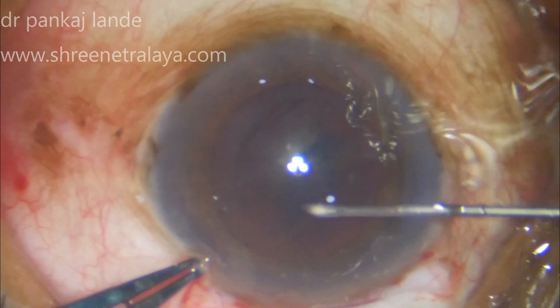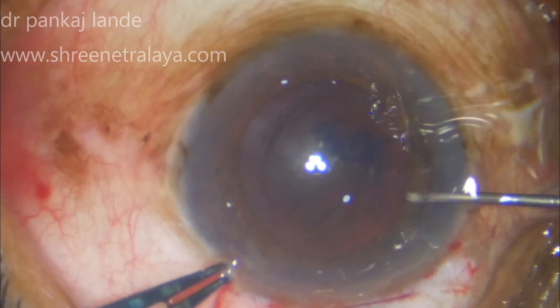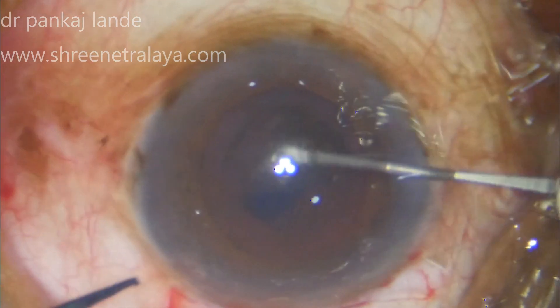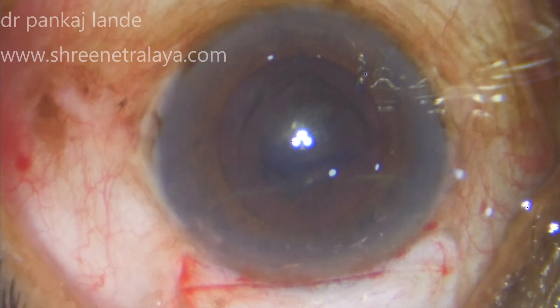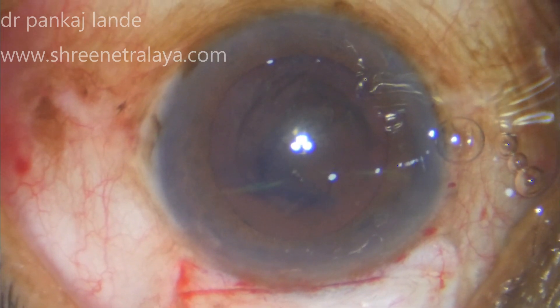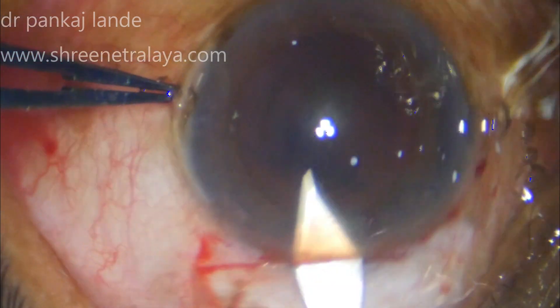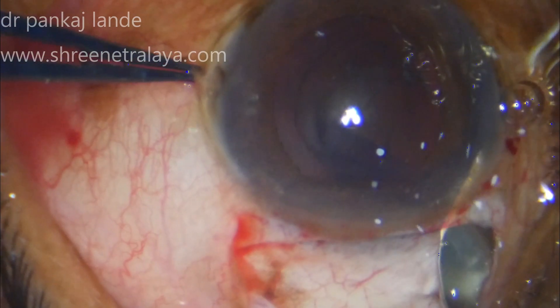In a few scenarios where you cannot perform rhexis, you can use a can-opener technique to finish off your capsulotomy. I am filling up the anterior chamber with viscoelastic again so that I have a firm eyeball before entering with my keratome.